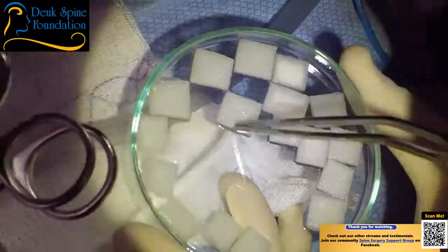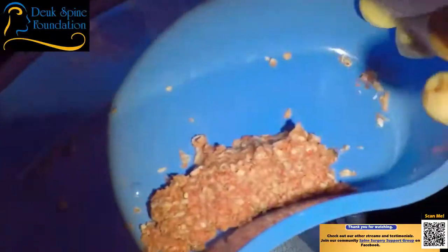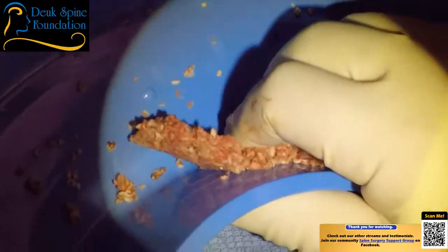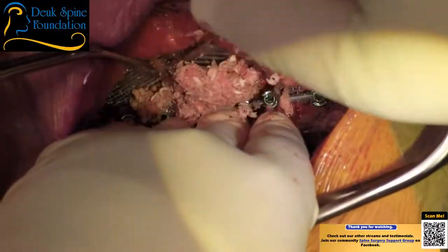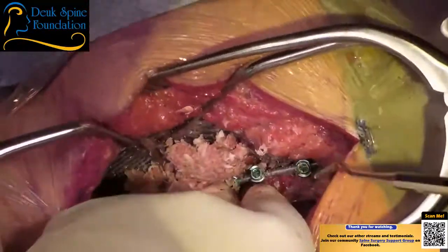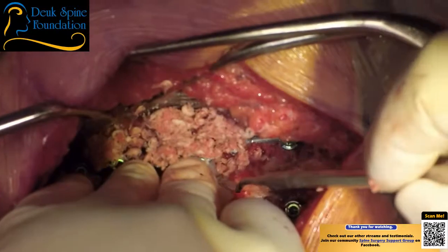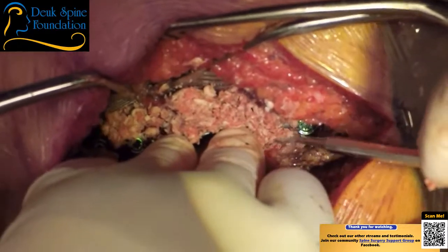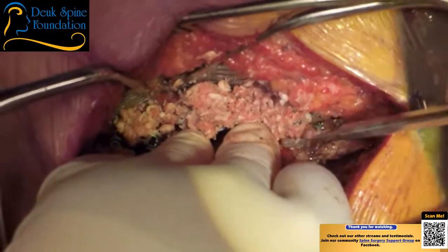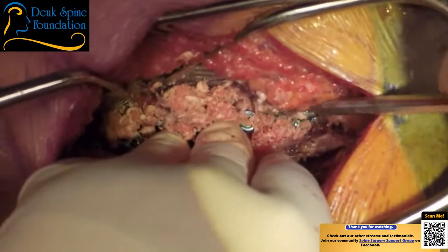So for those of you that joined us late, we're doing a posterior cervical laminectomy and fusion with instrumentation. And in the laminectomy, we're adding a foraminotomy, which we've already done. For those of you new to spine surgery, there's really three things spine surgeons are supposed to do, at least. Number one, decompression. That means get the pressure off the nerves. Why would you need to decompress? Well, if your nerves are getting pinched from narrowing, or your spinal cord's getting pinched from narrowing. Narrowing is called spinal stenosis.